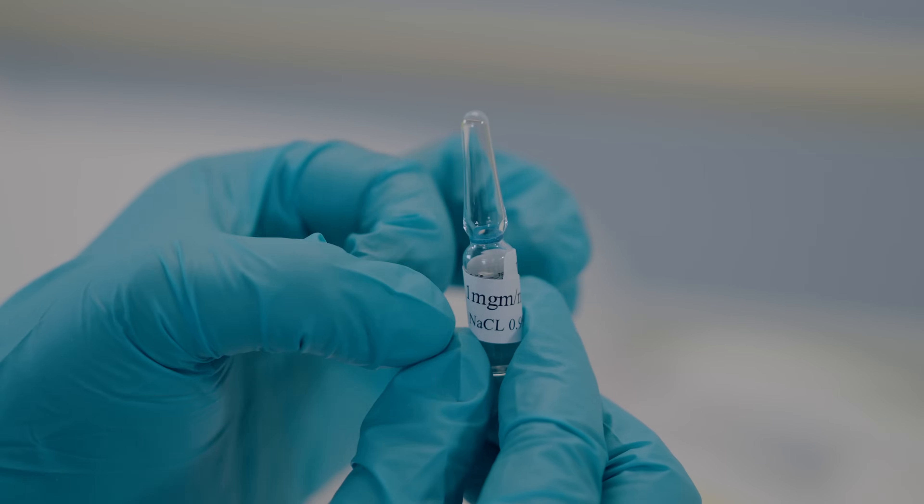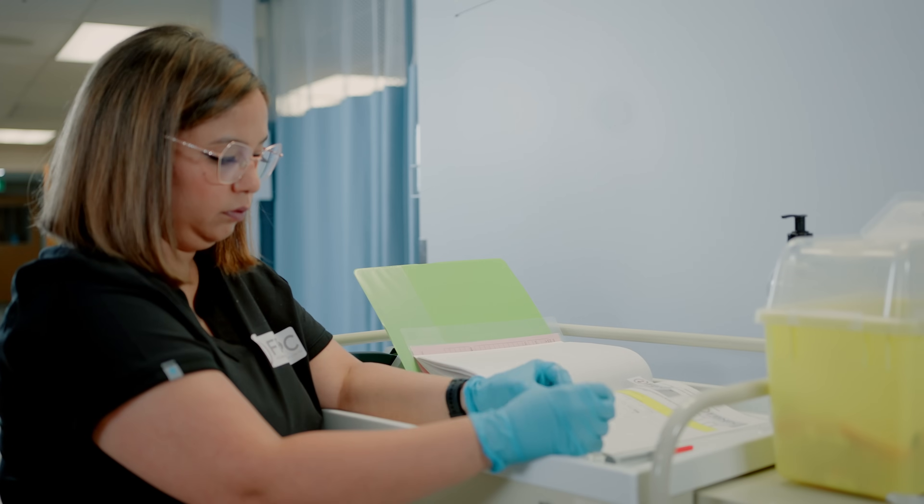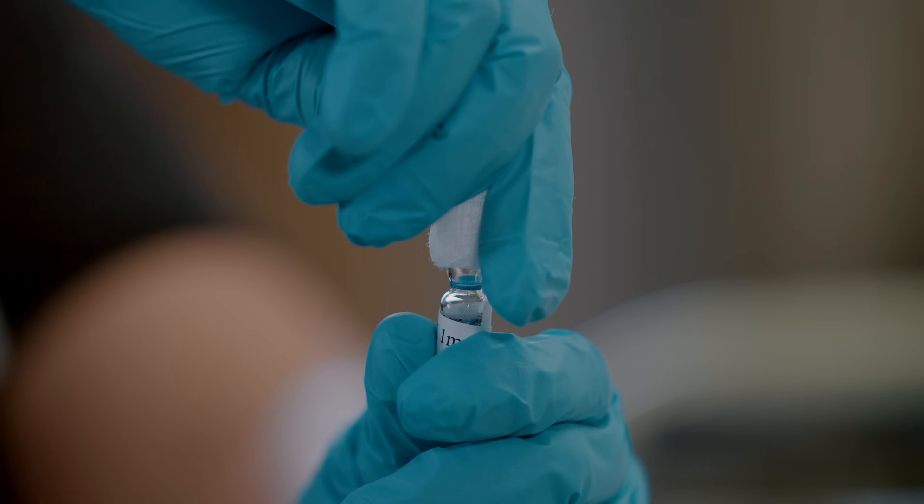You will see a little dot on the ampoule. If you see that dot, you want to wrap a gauze piece around the top of the ampoule. Or you can also use an alcohol swab to wrap it around the top of the ampoule.